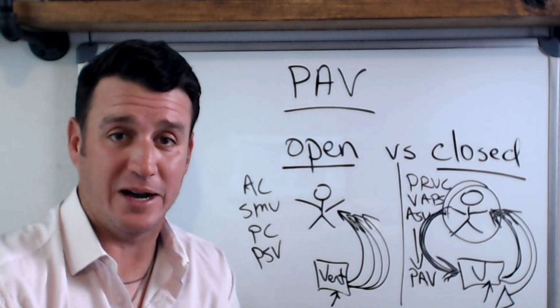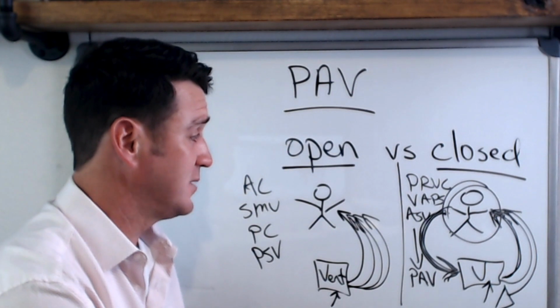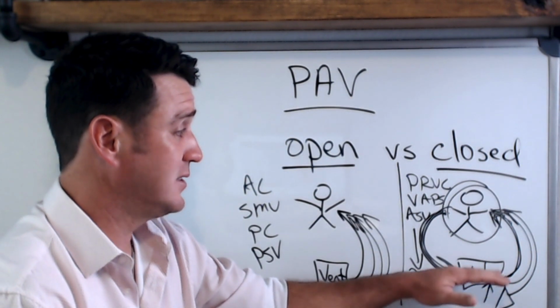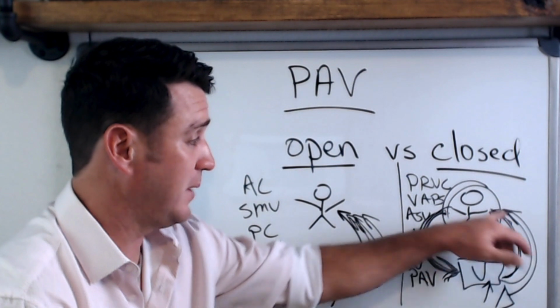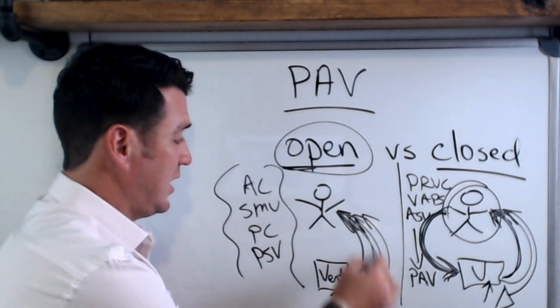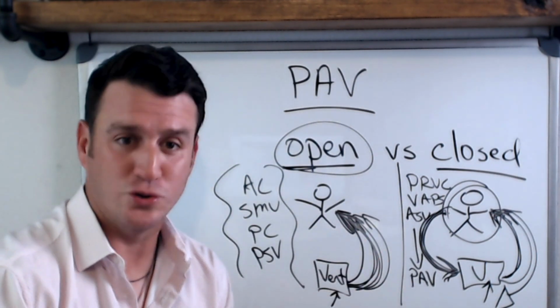So I apologize about my mistake. And it's important for you to understand this because these closed loop modes of mechanical ventilation, which is where the future of mechanical ventilation is going, the vent automatically makes changes in response to the patient, whereas with open loop, our traditional modes of mechanical ventilation, the vent does a job. It doesn't care about the feedback from the patient. Okay? Enjoy the rest of the video.